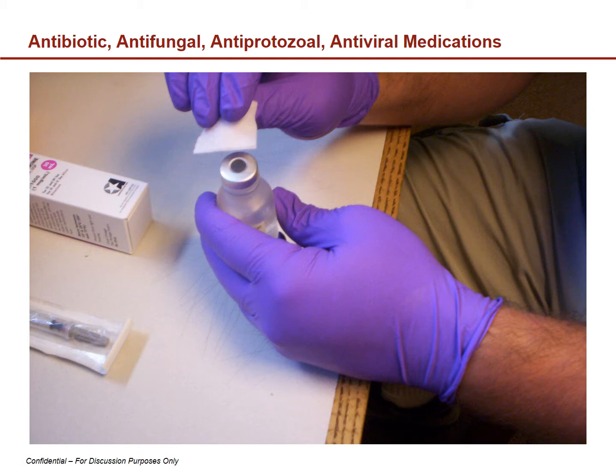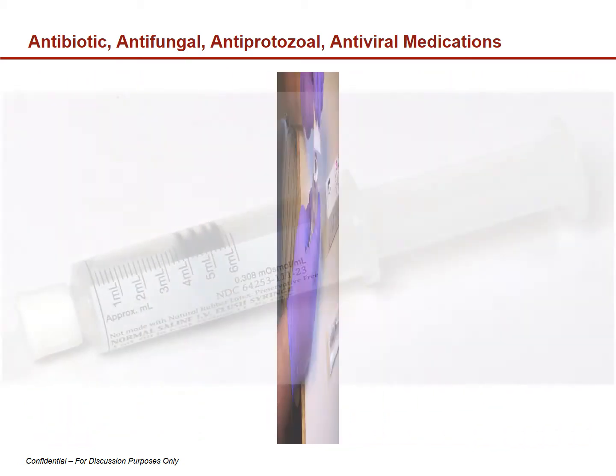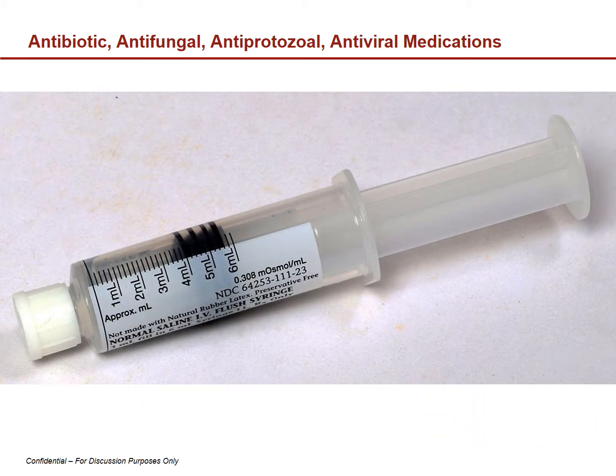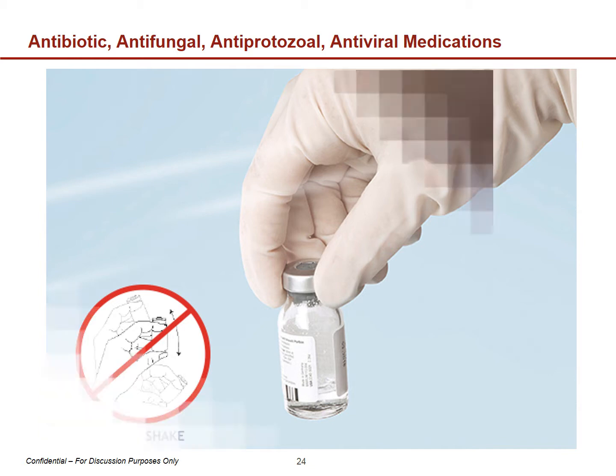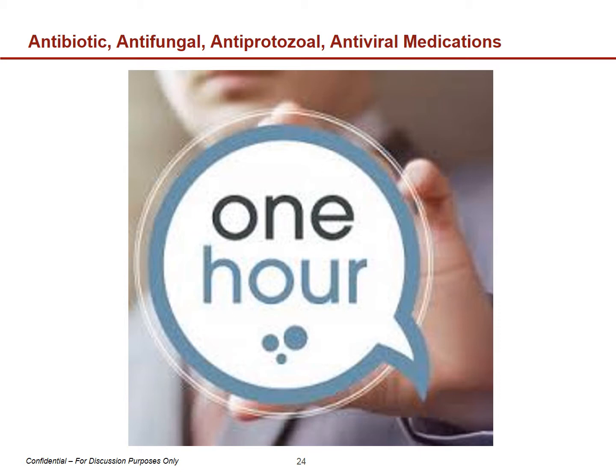Using a syringe with attached needle, withdraw 4 ml of saline and inject the saline into the colistin vial. Swirl the colistin vial gently until all the crystal deposited at the bottom of the vial disappears. Do not shake the vial, as the solution will become foamy. Transfer solution to a nebulizer for immediate administration. Any unused colistin must be discarded if not administered within 1 hour from preparation.